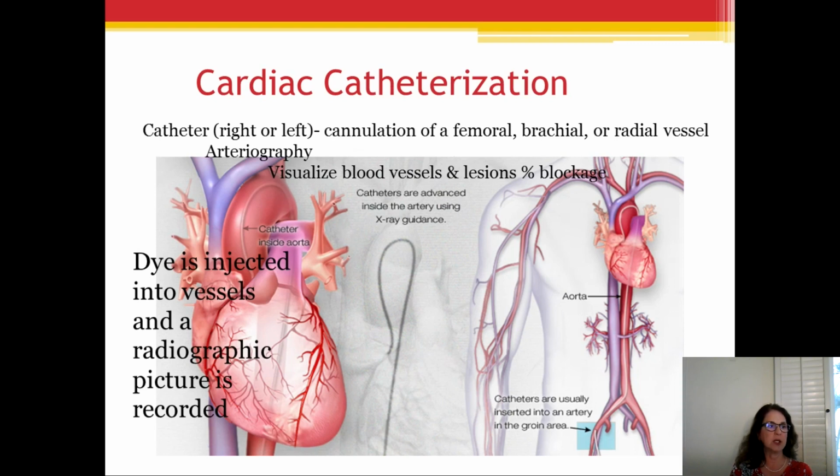Left heart cath is the concept of visualizing the coronary arteries to see what extent of infarction there might be, to view the bypass grafts to see how they're doing, if somebody already had been grafted, to evaluate angina-related spasms, and certainly to sometimes perform interventional caths like a percutaneous coronary angioplasty, which is the balloon going in, and we'll show you pictures in a minute, or placing a stent, which I'll show you that too. Dye is generally injected into the vessels, and you're taking a picture, recording that as you go.